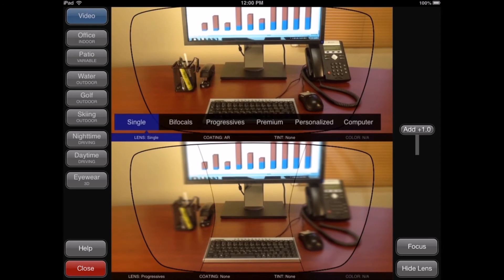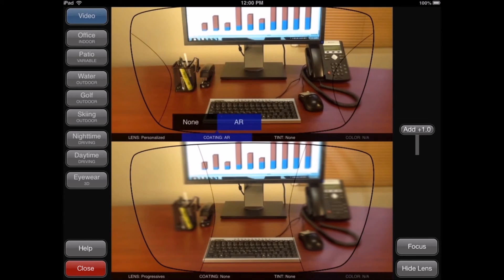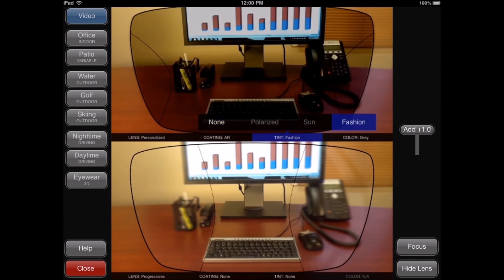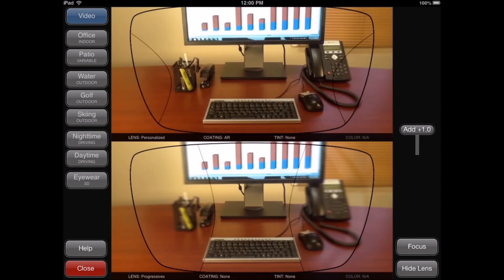The lens type, the coating, the tints, and colors.